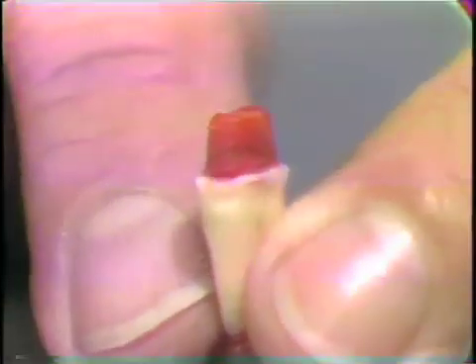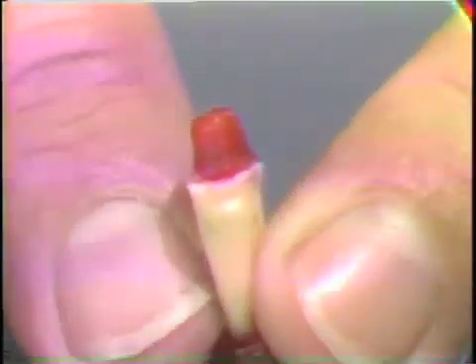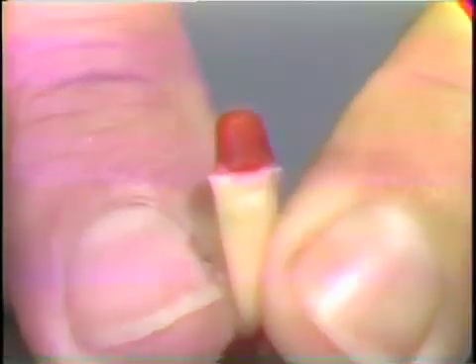This is not actually a composite resin. You'll recognize it as Duralay, which is used just to illustrate the situation here because of the color difference and the ability to contrast well with the tooth and show easily on the screen. This core would have been built up in composite to an approximate shape, and then is finished and cut with the usual cutting instruments. Notice that this has a shoulder all around the preparation. It's intended to receive a complete crown, a veneer crown in a maxillary bicuspid, and is made with a shoulder all around with a bevel to that shoulder.